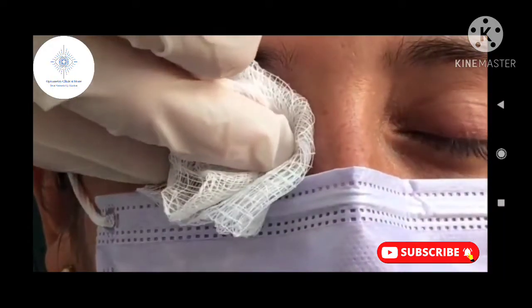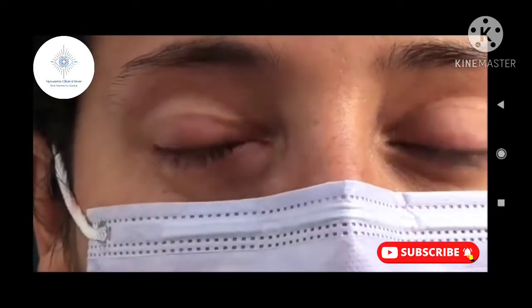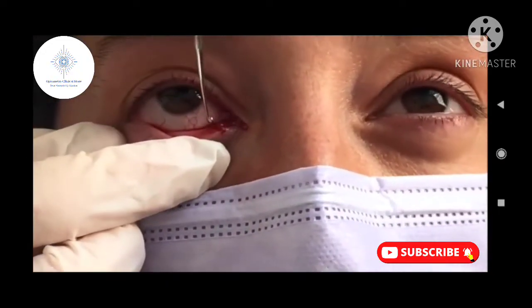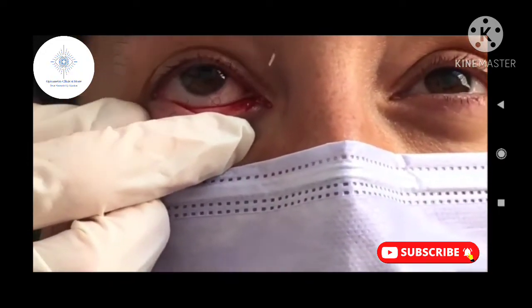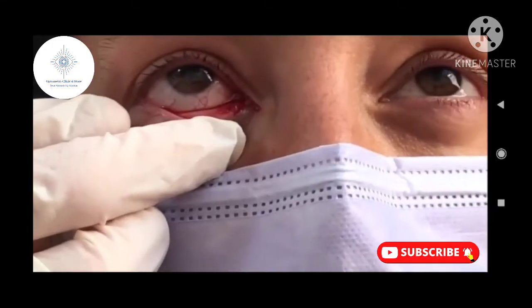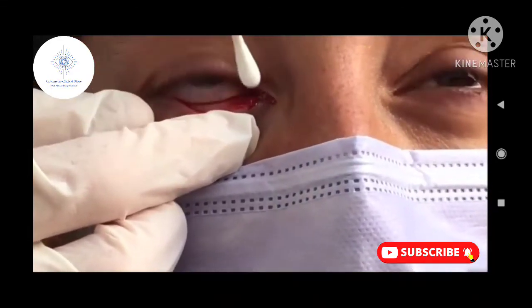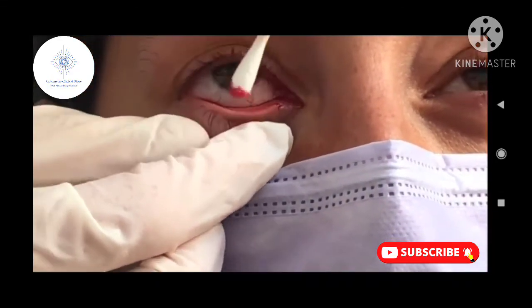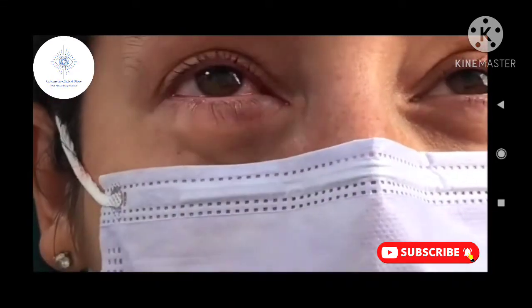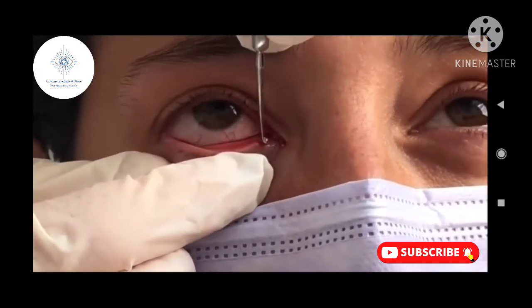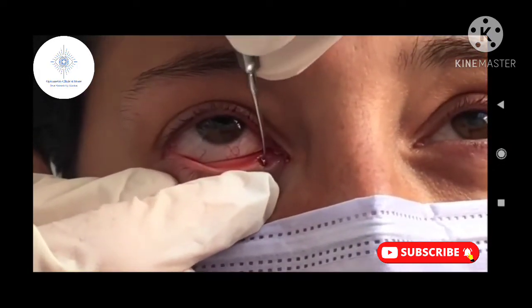Sometimes significant force needs to be generated to really remove the stones and mucopurulent discharge, but once the discharge has been completely debrided, the infection can be cleared without an incision in the canaliculus.